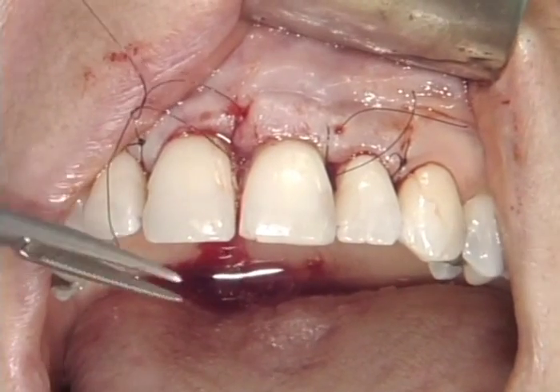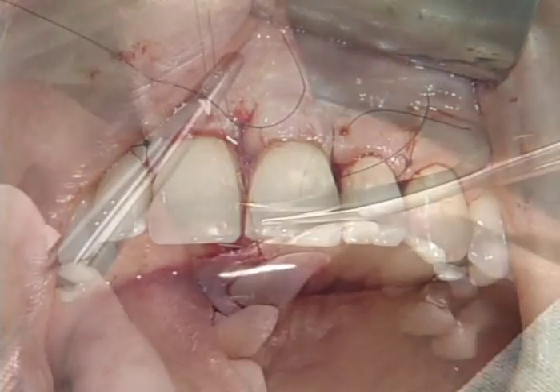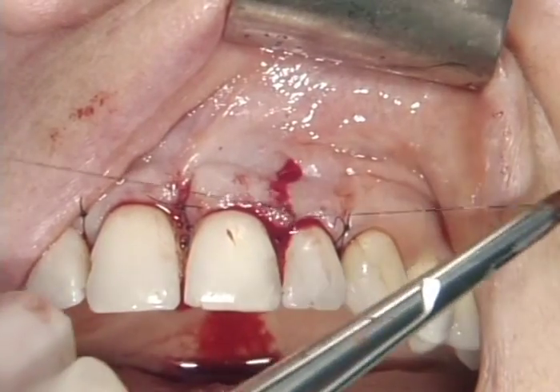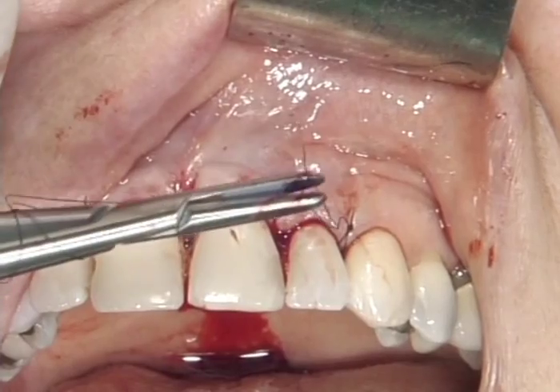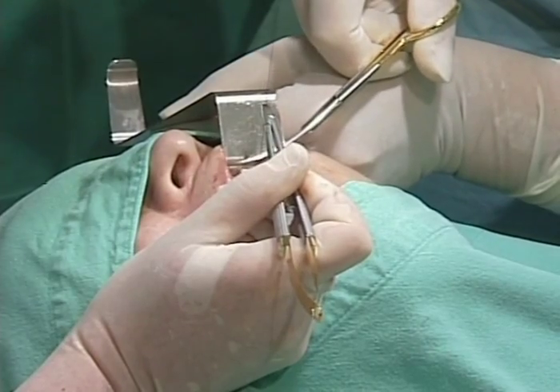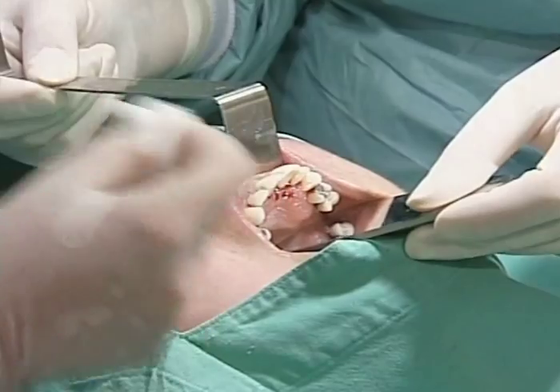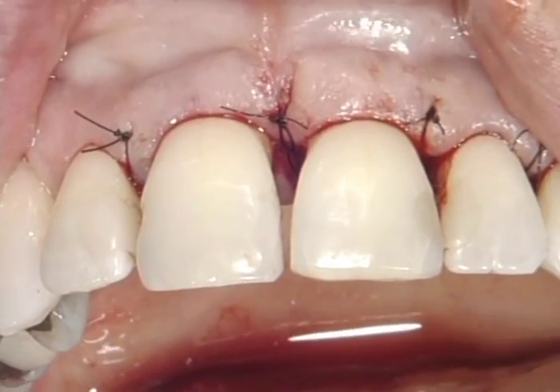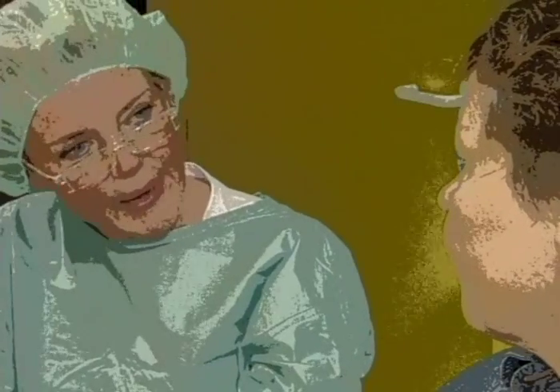The prepared pre-sutures are tightened in a tension-free manner for final wound closure. At this stage of the surgery, the assistance of a well-trained nurse is very helpful. The mirror view and final picture of the labial region shows good soft tissue adaptation and tension-free wound closure. Another important factor for treatment success is adequate patient instruction. For further information, read the guidelines for use carefully or contact your local Straumann representative.